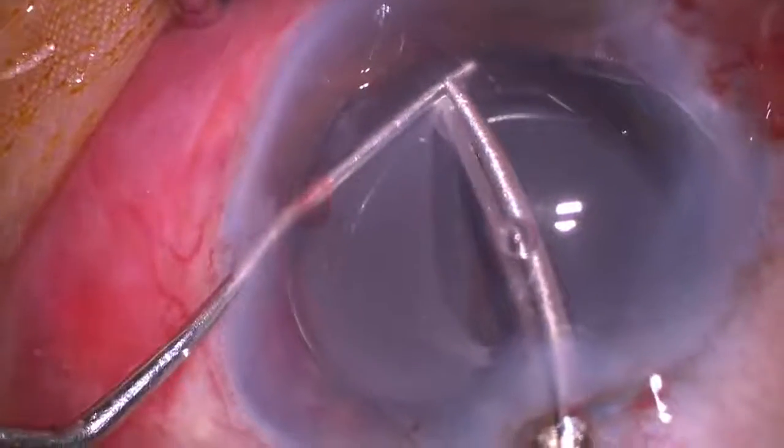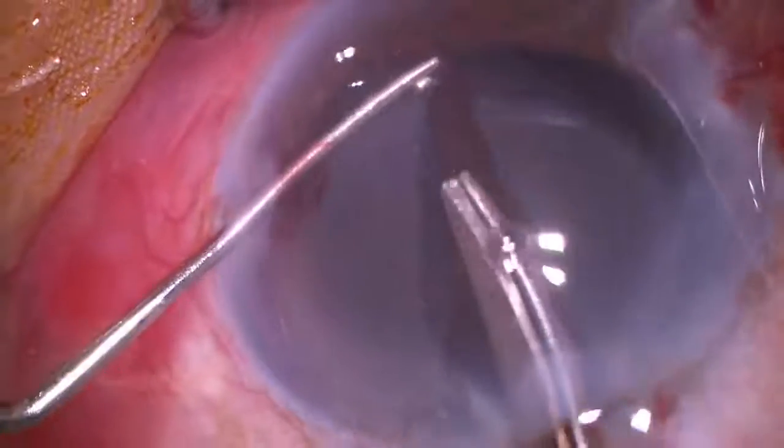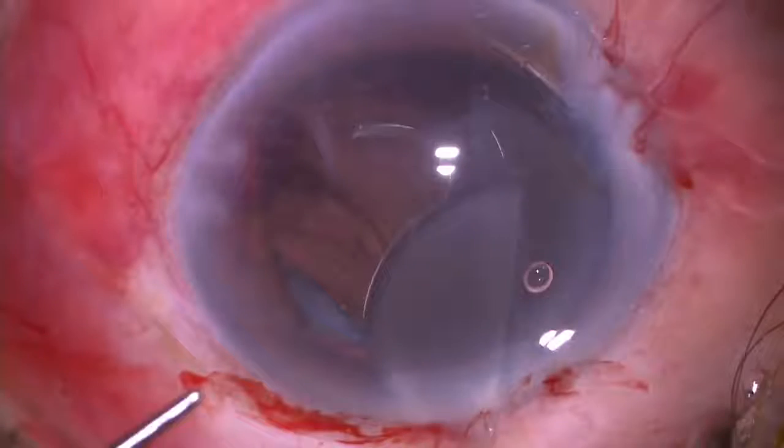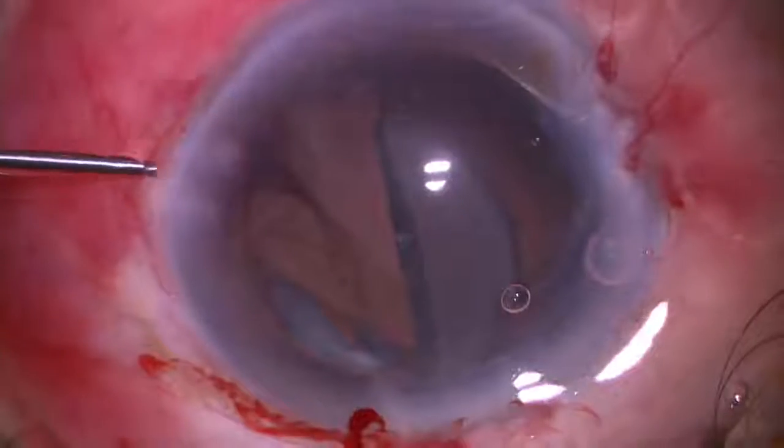Optic of the IOL was cut. The two halves of the optic were explanted from the micro-incision.